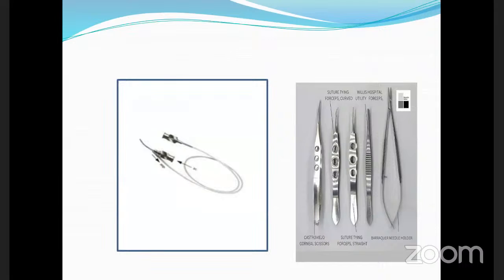So these are very small things, but they make a lot of difference when you are dealing with complicated cataracts. And this is a Simcoe cannula. I just want to give some idea about the Simcoe cannula. It is a combination of two cannulas, in which one is the aspiration port, one is the irrigation port.